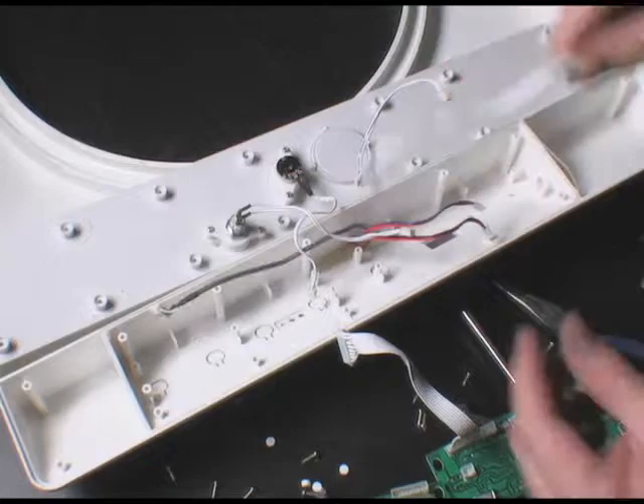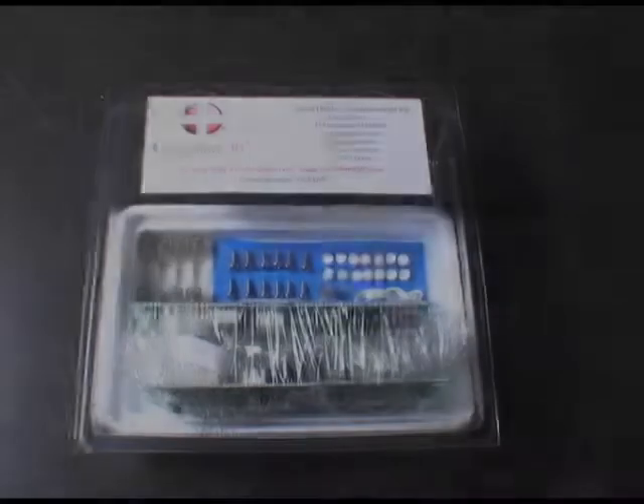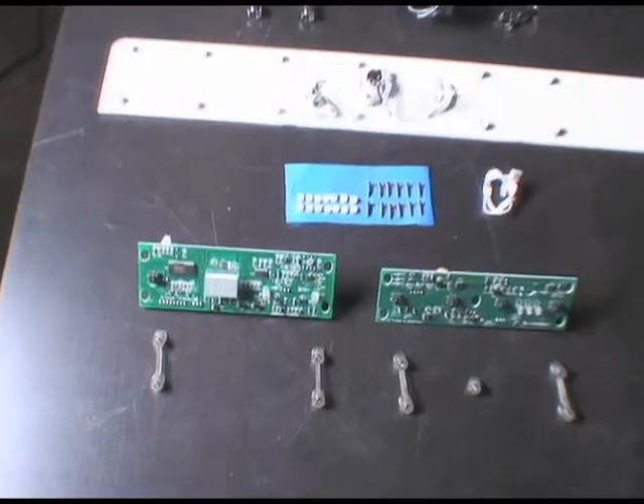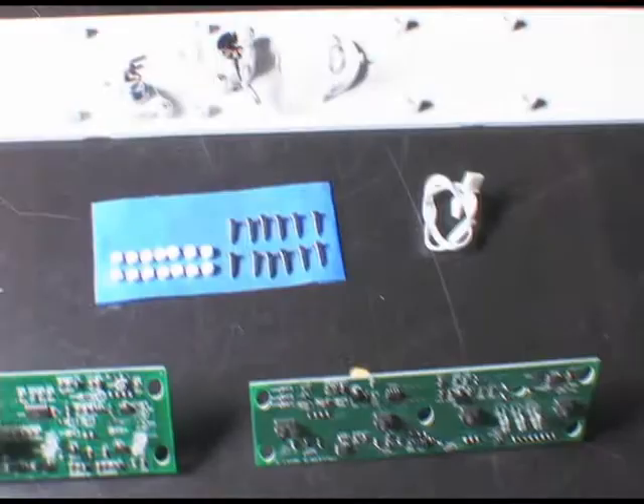Disassembly is now complete. Replacement of the boards can be achieved by reversing the instructions. A replacement parts kit is available that includes the PCB and MCU boards, the connector harness, five mounting insulators, nine mounting screws, 14 bottom panel screws, and 14 bottom panel screw covers.